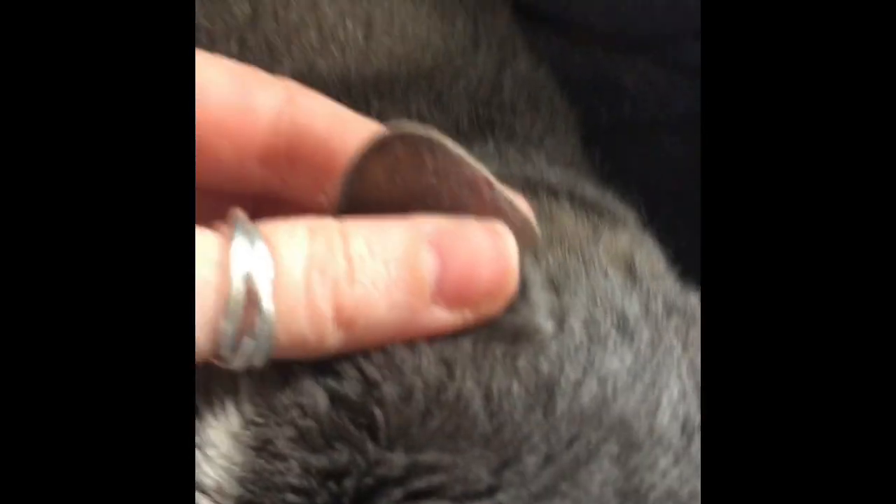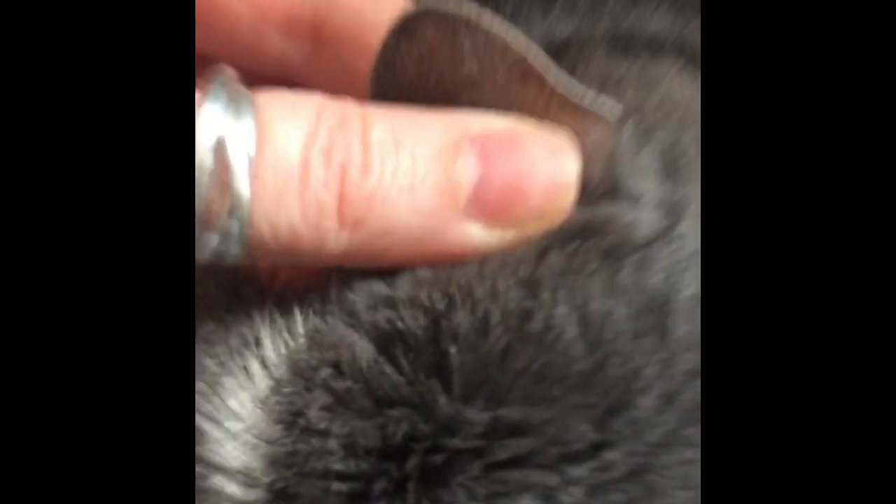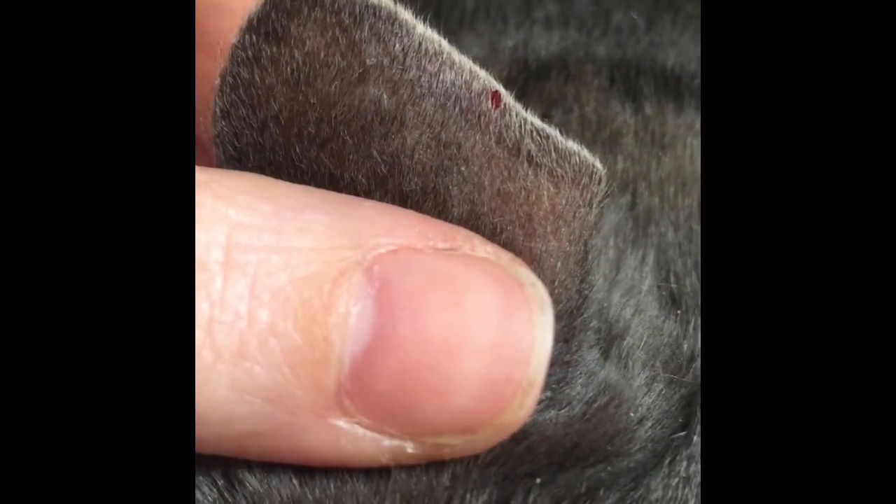Now I'm going to just massage the ear just a little bit. It's starting to come out. So I'm going to put the meter strip in now so it'll start to register. Just massaging it. There's a little dot — that's all you need. It's like the period at the end of a sentence. It's like nothing.